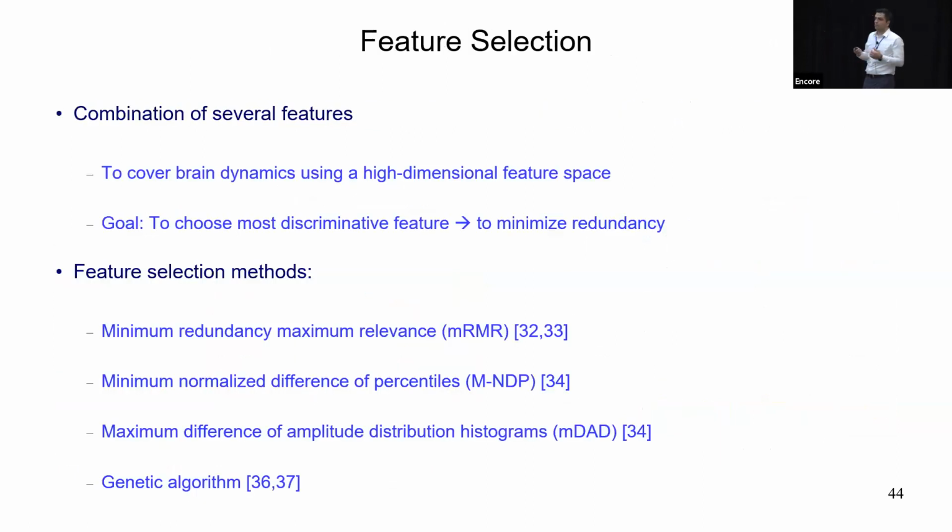So we talked about two different features, and we showed a long list of other features that are out there. But then how do we choose which feature to use for our classification? Generally, we don't need to go with just one. We can definitely go with more than one feature, and that's what people typically do.